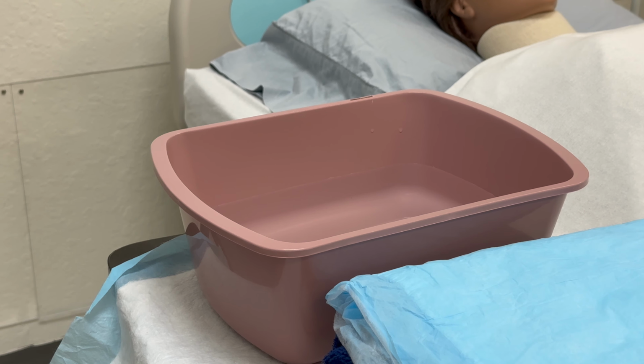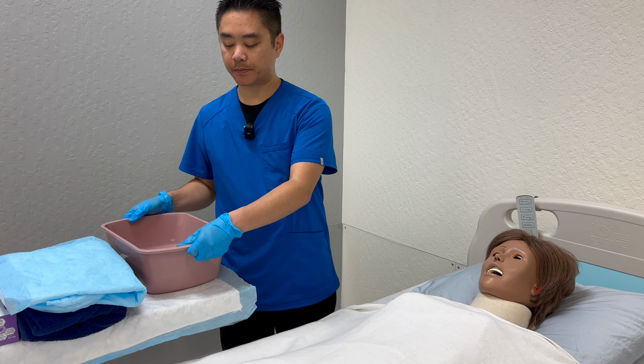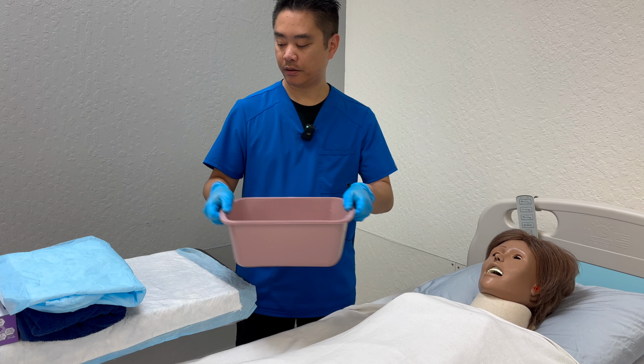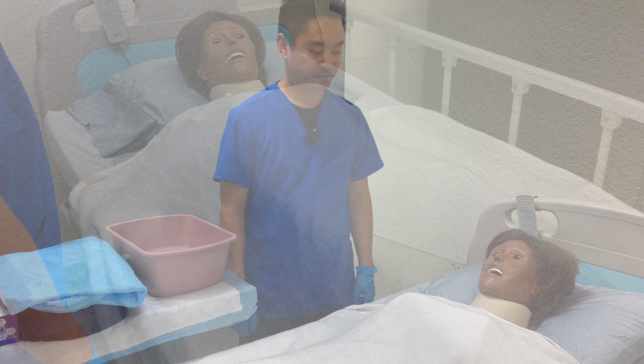Before washing, check the water temperature for safety and comfort. Mrs. Smith, can you please check the water temperature? Okay, so we're going to go ahead and start the procedure.